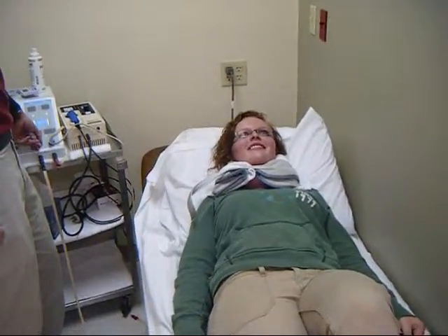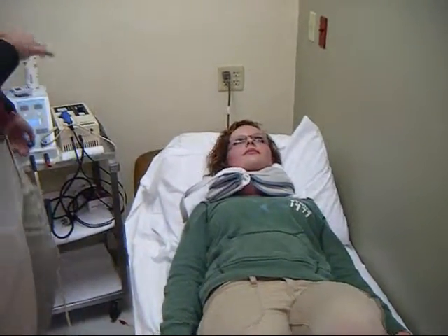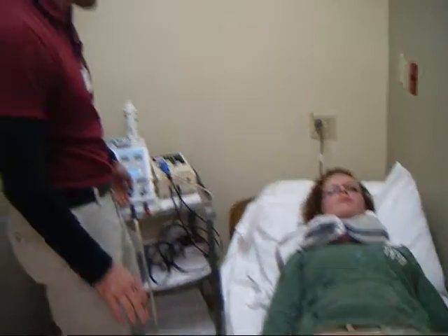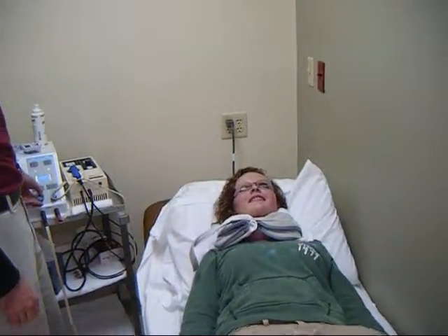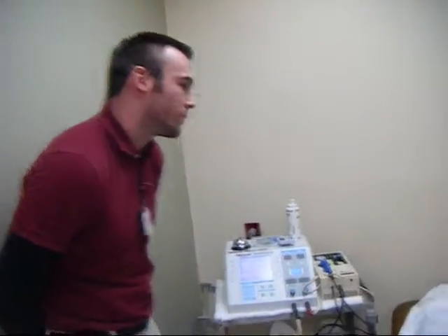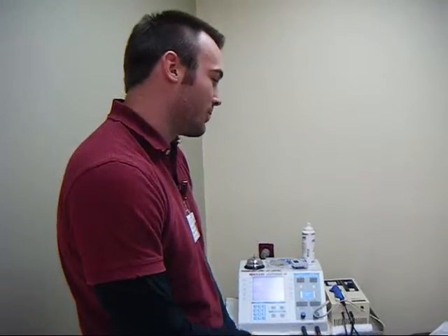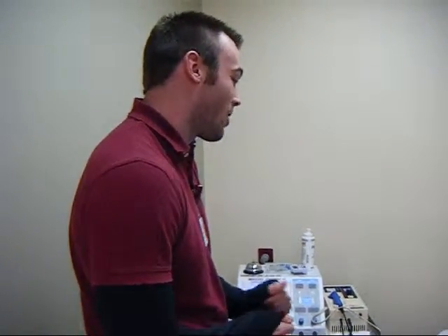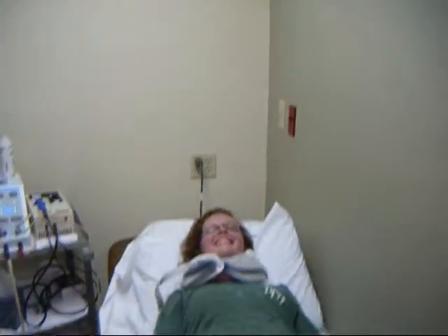Let me know when you first feel it. And then what we want to do is go up as high as you possibly can tolerate it. So once it gets into the very strong feeling range, let me know and that's as high as we'll go. So let me know when to stop. Right there — you're going to be 20 minutes. The sensation is going to kind of lower as your body gets used to it. So every five to ten minutes, either me or Christy is going to come in, check in on you, and ask would you like me to turn it up? And you'll say absolutely, or you'll look at me like I'm crazy and say no, it's still pretty strong. Any other questions, or do you just want to sit back and relax for the next 20 minutes?